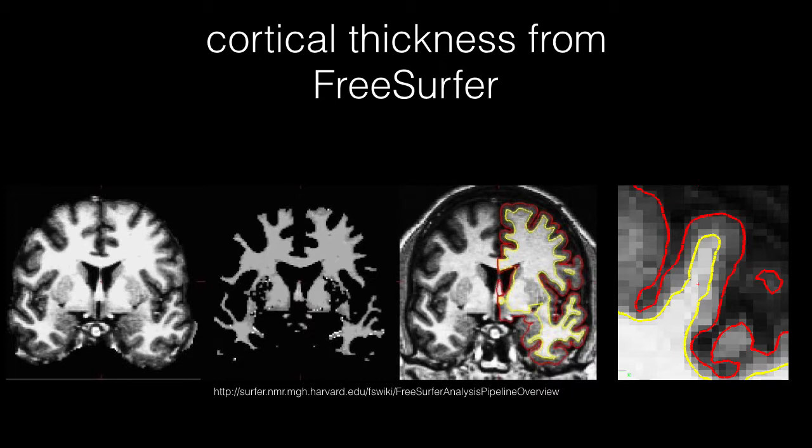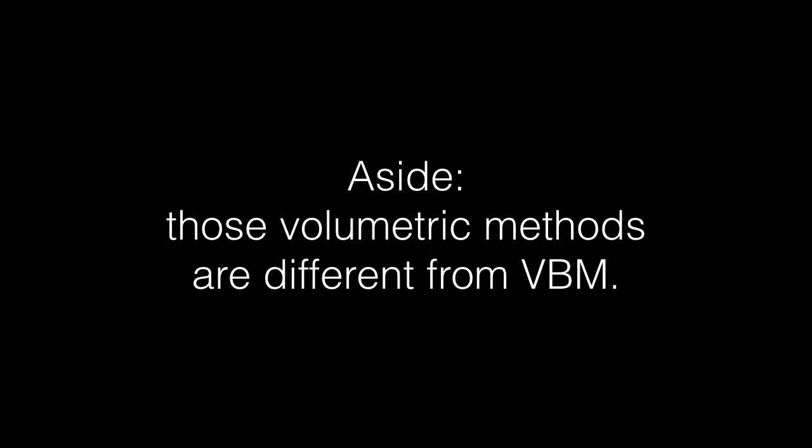If you look at those red and yellow surfaces and picture all of the individual spots where you can calculate the distance between the surfaces, it's easy to imagine how you could create a whole brain map of how cortical thickness varies across the brain surface. And in a few slides, I'll show you an example of how that kind of map can be used to analyze age-related cortical thinning. So that was a pretty brief overview of the range of methods we use to measure the volume of brain structures.